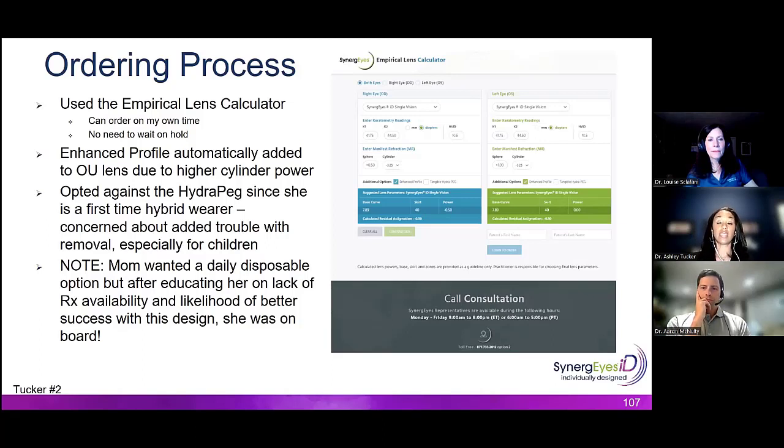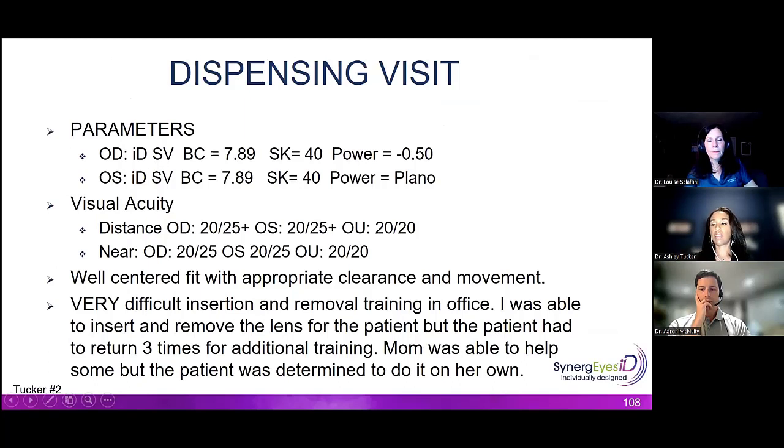I opted against HydroPeg for her because she's brand new. She's only 8. I didn't want anything to hinder the process of inserting or removing the lens, because HydroPeg, as wonderful as it is, is very slippery. So it can really hinder someone from being able to take the lens out successfully. Again, mom wanted a daily disposable, but because this is really the best option for the patient, mom was all in. These are the parameters that we decided to order based on the calculator.